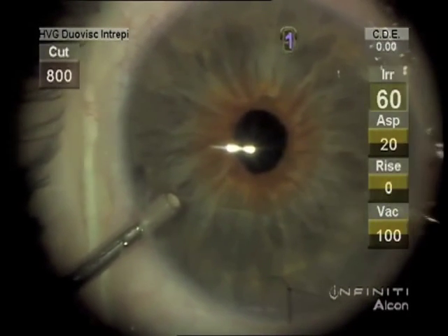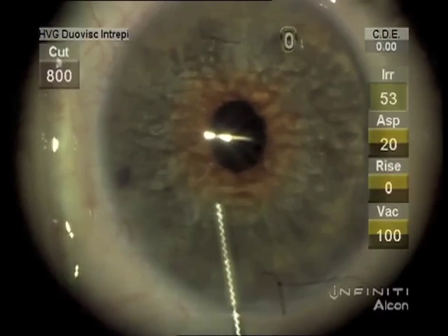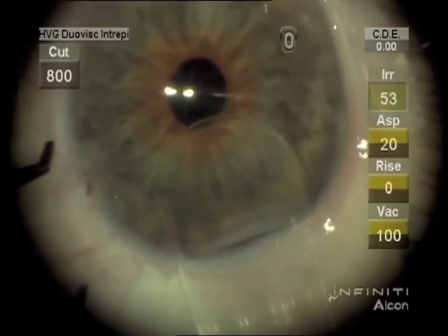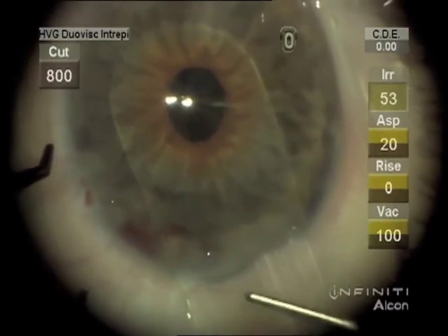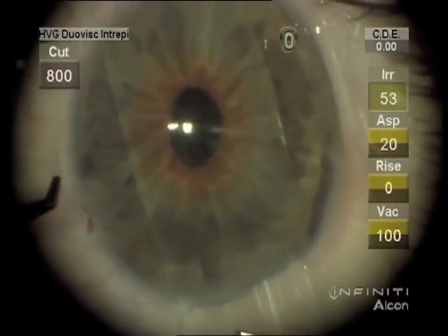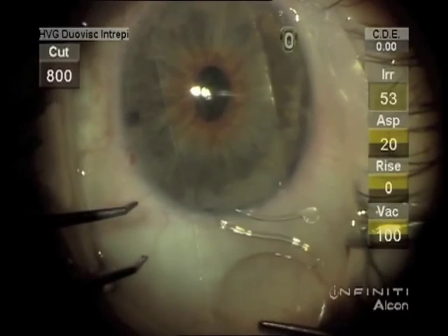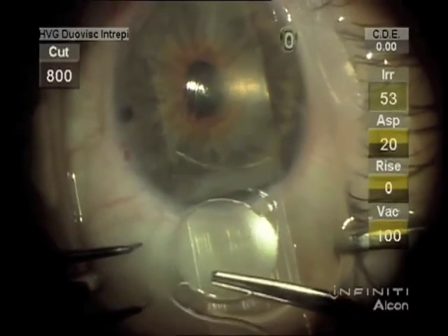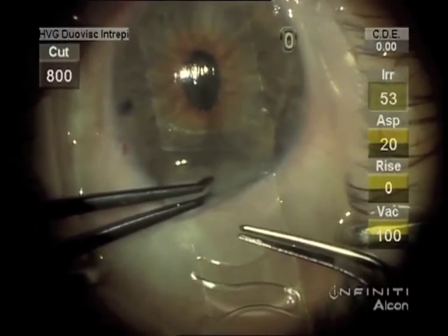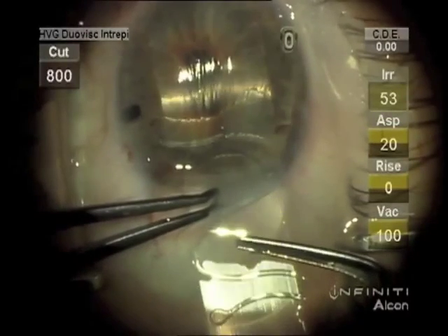Then checking again to make sure there isn't any vitreous. Viscoelastic instilled. A lens glide placed. And the quadriflex lens designed by Dr. Kelman slid across the sheets lens glide.